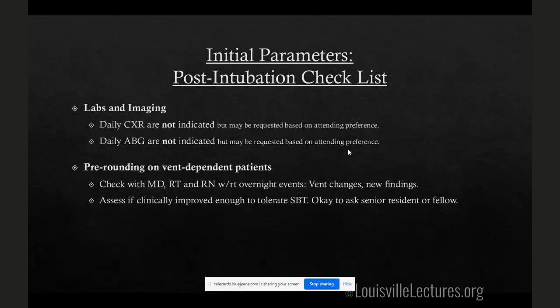And then over time, as you get a feel for this, then you can start suggesting, well, you know, the patient's stable, they're improved on the vent. Can we try a spontaneous breathing trial? And you'll get there.